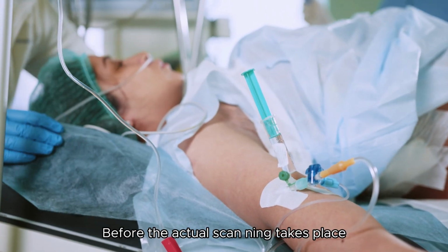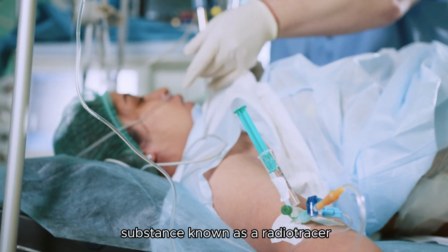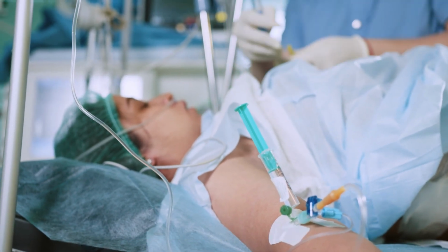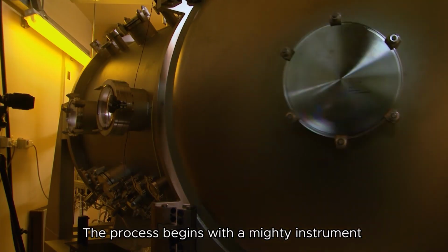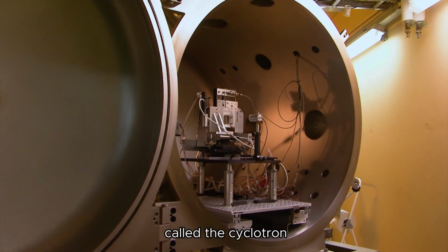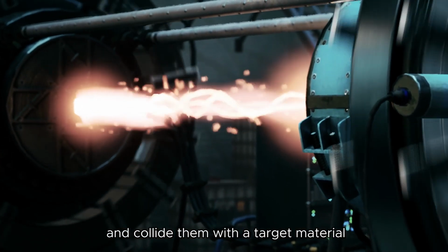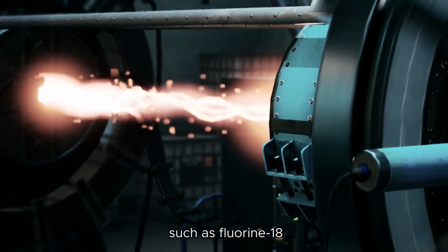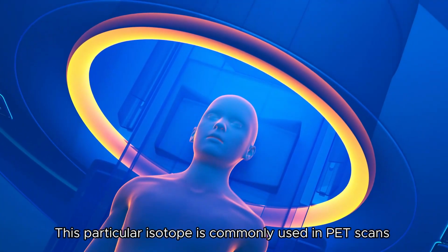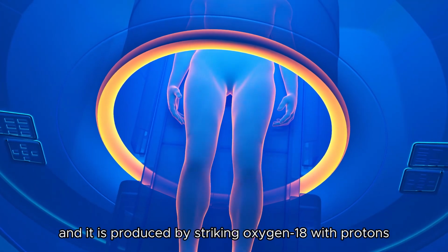Before the actual scanning takes place, the patient is intravenously injected with a unique substance known as a radiotracer. How is this radiotracer concocted, you may wonder? The process begins with a mighty instrument called the cyclotron. Its job is to accelerate charged particles and collide them with a target material, consequently creating radioactive isotopes such as fluorine-18.